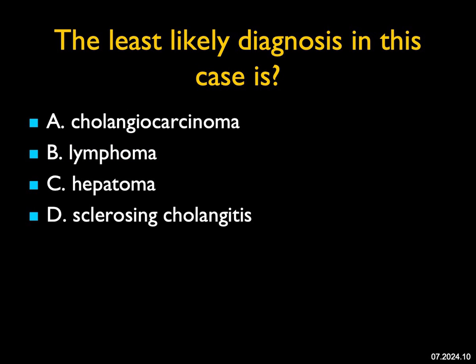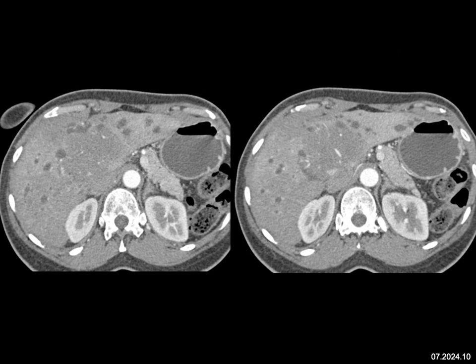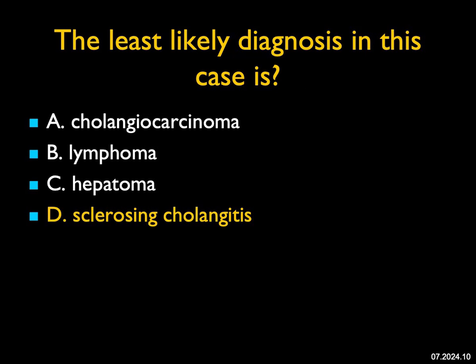The least likely diagnosis in this case — again, least likely. I see an infiltrating tumor in the hilum of the liver with dilated ducts. To me the most likely diagnosis would be a cholangiocarcinoma. Hepatomas can be solid masses but usually don't cause duct obstruction. Occasionally we'll see lymphoma as bulky masses, and they too can cause dilated ducts. To our surprise, we thought this was a cholangio, but on biopsy it ended up being a B-cell lymphoma causing duct dilatation. The one thing this is not is sclerosing cholangitis — you see some duct dilatation, you don't see a big common duct, and there's a large mass present. Some patients with sclerosing cholangitis have an increased incidence of developing malignancy, but that's not the case here. The least likely diagnosis was sclerosing cholangitis.